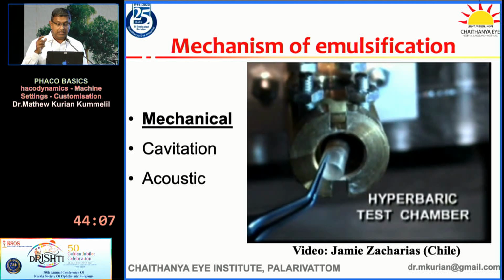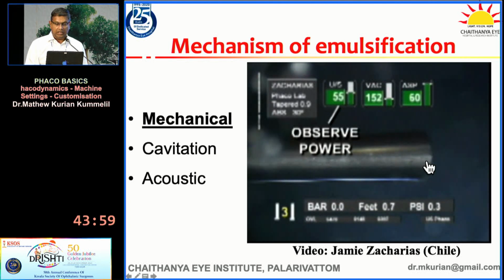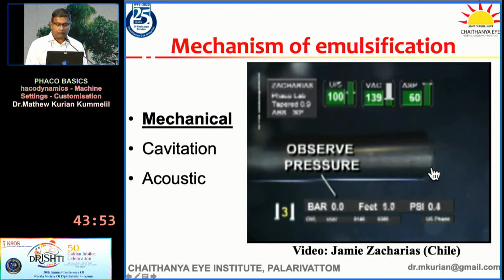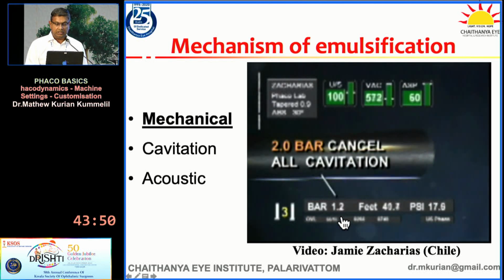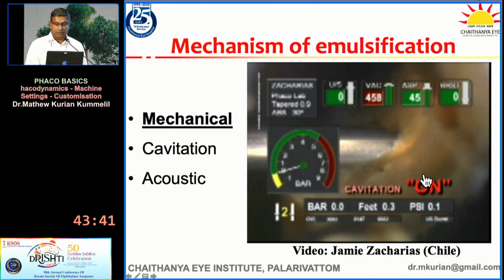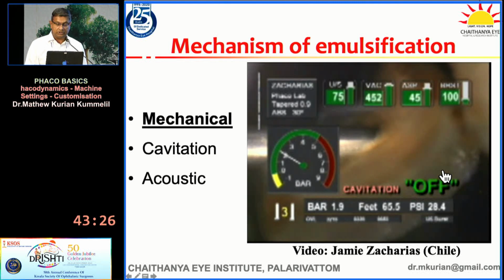There was a thought that mechanical, cavitation and acoustic energy all work on the eye, but if we increase the power, you will see that at a certain point, small bubbles, which are the cavitation bubbles, will appear at the tip. And then as we increase the pressure inside this hyperbaric chamber, you will see that the cavitation bubbles get cancelled. So Jamie Zacharias made this award-winning video where he was able to demonstrate that with cavitation and after increasing the pressure without cavitation, the efficiency of the phacotip in emulsifying or embedding into the lens matter was equal.